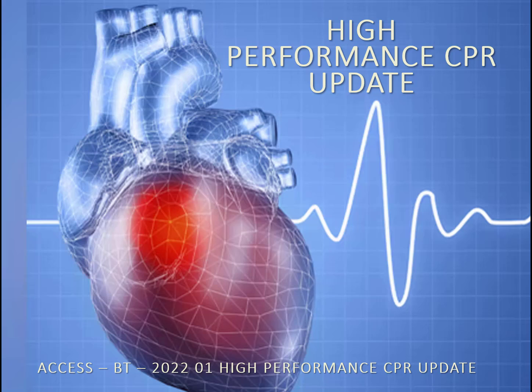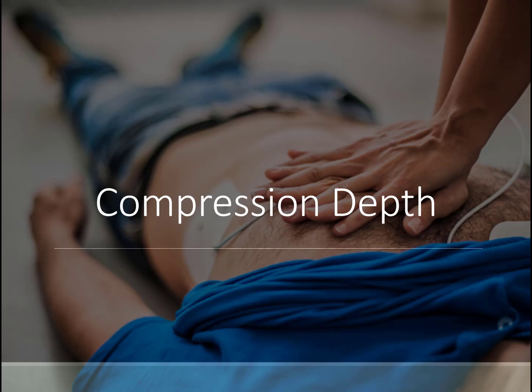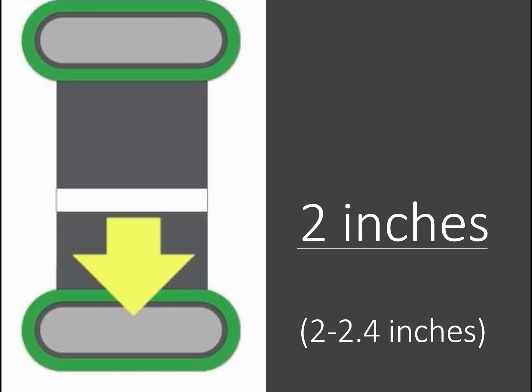And today, for this video, we're going to talk about compression depth. Now, this is something that's often overlooked. We assume that if we push hard enough, that we are in target, but that's not quite true. It's important to realize that our goal is a target greater than 2 inches for adults, preferably in the range of 2 to 2.4 inches.